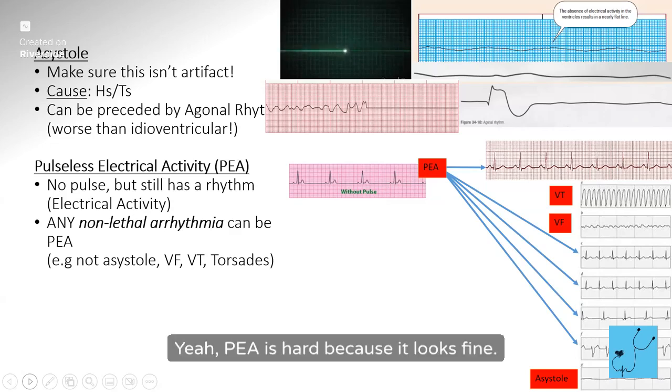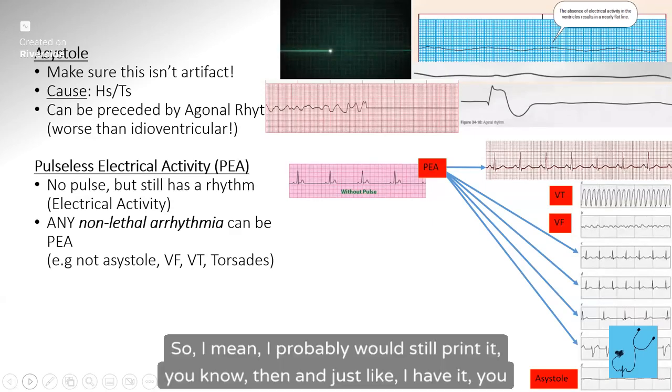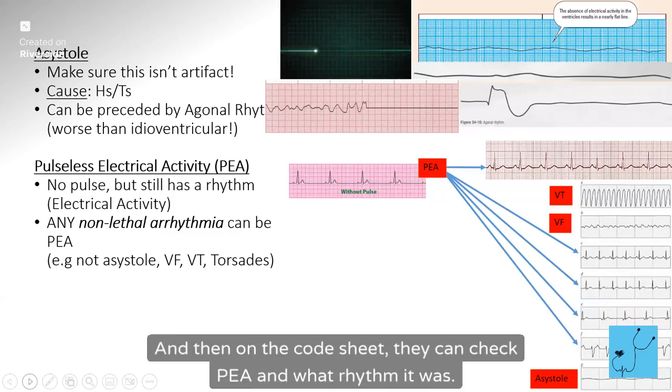Yeah, PEA is hard because it looks fine. So why would you even call? They call it code blue. The patient looks fine, and then they came in and said, no, he didn't have a pulse. I would probably still print it, just so I have it, and then the nurse is going to document that there's no pulse and all that stuff. And then on the code sheet, they can check PEA and what rhythm it was.